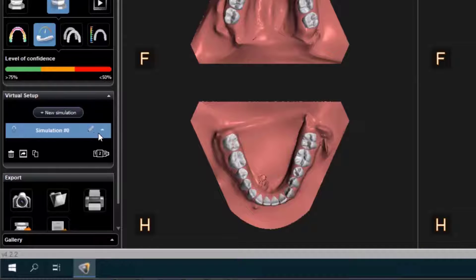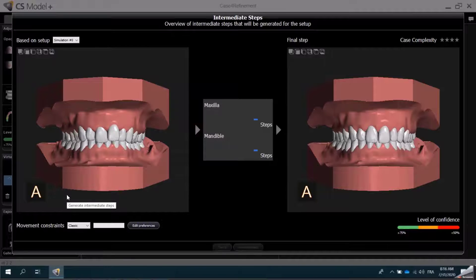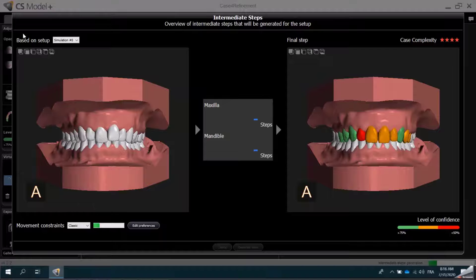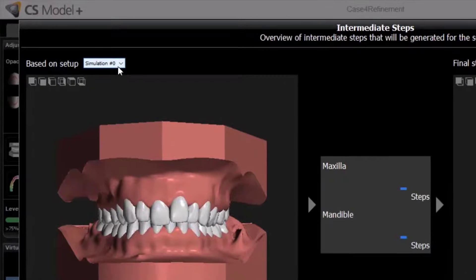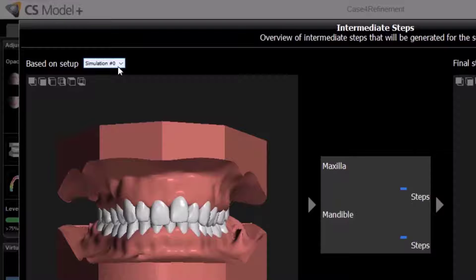To create the models that will be used to fabricate the aligners for each step of the treatment, I'll click Generate Intermediate Steps. CS Model Plus automatically calculates the number of steps required to achieve the treatment outcome based on the proposed setup. In the upper left corner, you can see that the intermediate treatment steps are based on simulation 0.